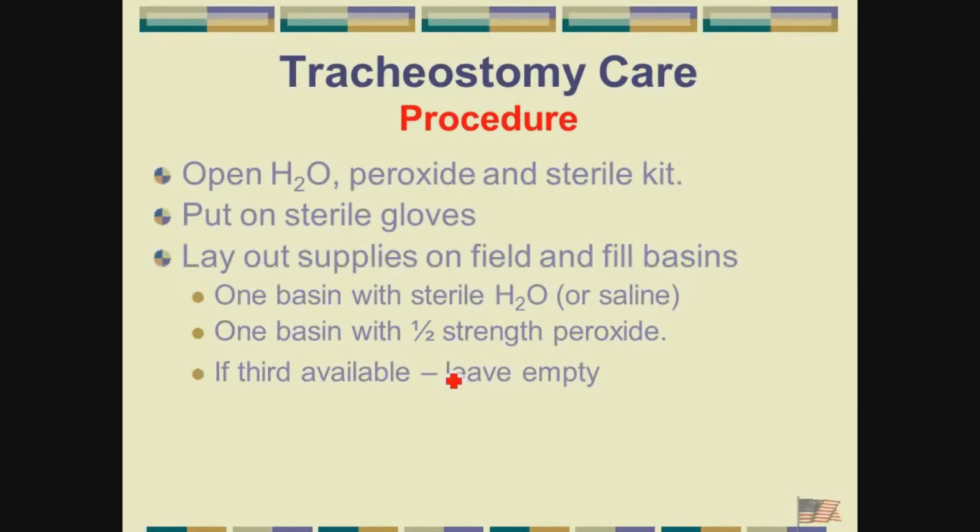Go ahead and open up all of our equipment before we put on our sterile gloves. So we're going to have the kit opened to the extent that I can access it. I want to have my water or saline open. I want to have my peroxide open. Go ahead and put on my sterile gloves, and now I have the creation of a sterile field.